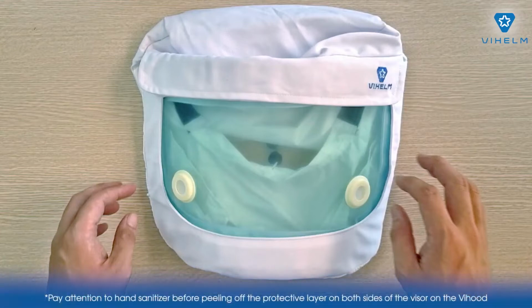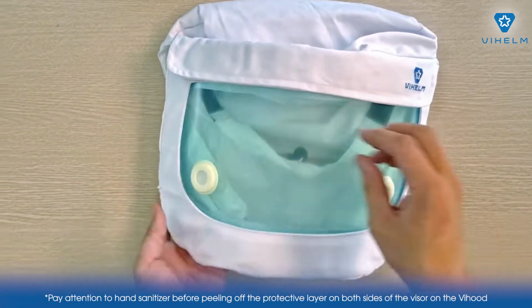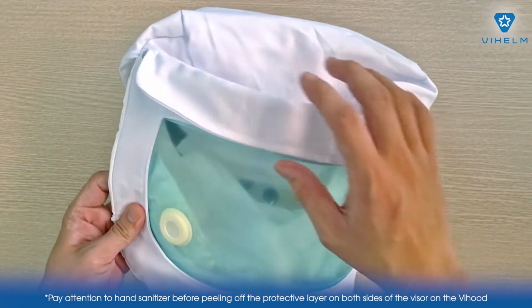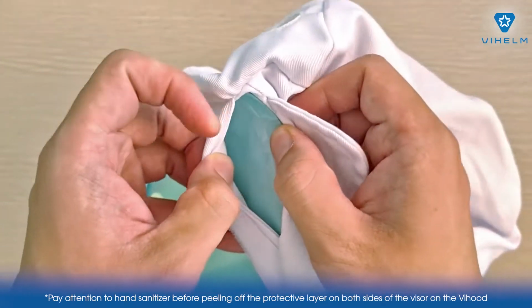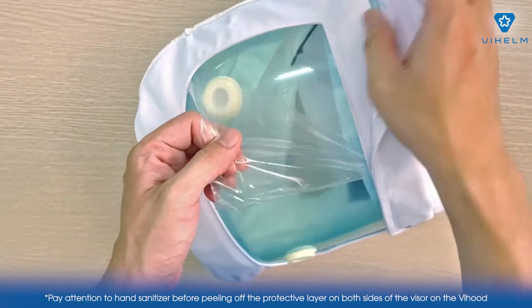When the customer uses the pre-assembled Vihood for the first time, it is necessary to peel off the protective film on both sides of the visor. Step 1. Loosen the exhale filter holder on the visor. Step 2. Open the velcro tape on the top of the hood cover a little bit. Step 3. Using a fingernail, gently scrape and peel off the protective film on the visor outside the Vihood.